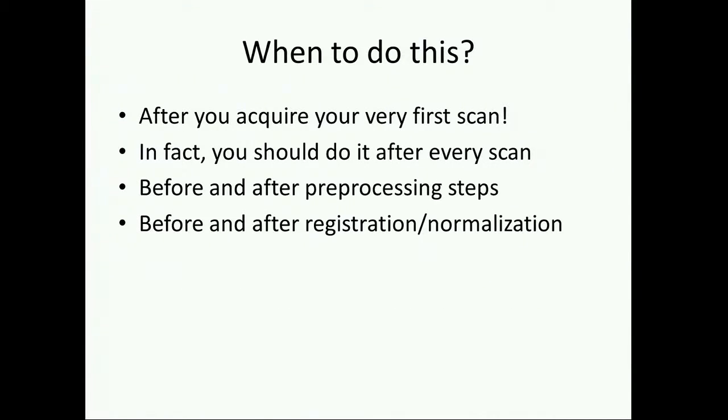In addition, you should probably keep checking your data visually before and after pre-processing steps, before and after registration and normalization, which is something that Emma's seen a lot of issues with and picked up because she checks her data. So there are a number of places where you should do this, and I think that no automated tool can substitute for this, essentially.